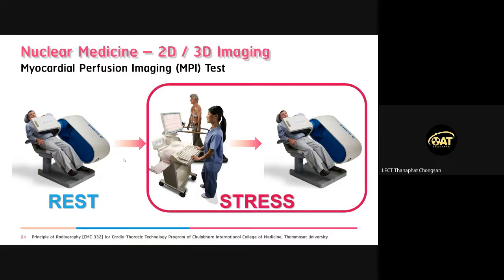For the MPI test, the patient will be examined in two steps, the rest step and the stress step. For the stress step, before testing with this machine, the patient will exercise. Okay, and the next step is testing with this machine.